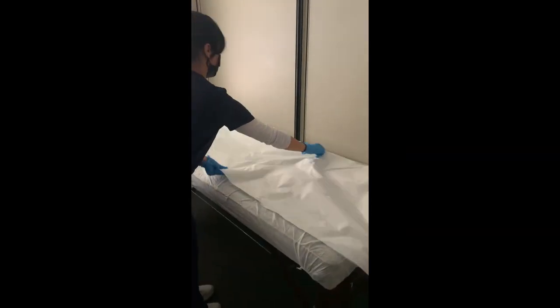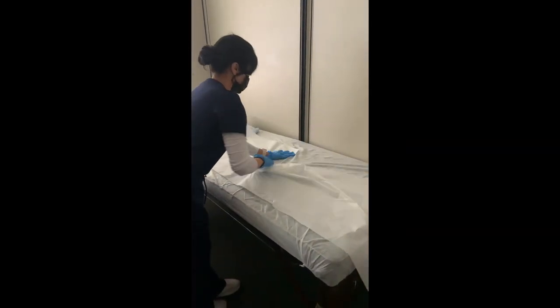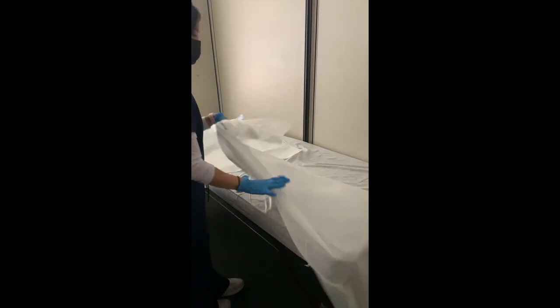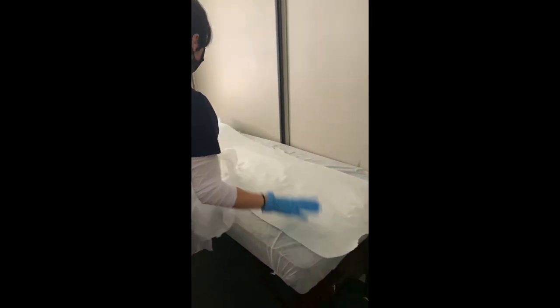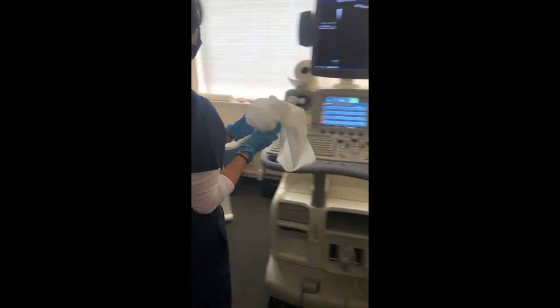Regularly check the supply inventory and maintenance of the equipment. At the end of each exam, clean the bed and prep it for the next patient. Remember to properly dispose of used items, including PPE.